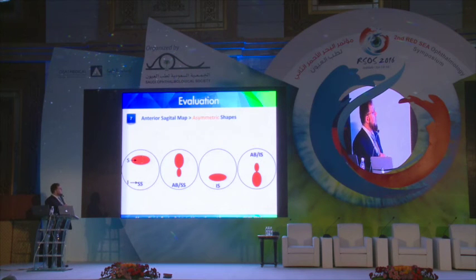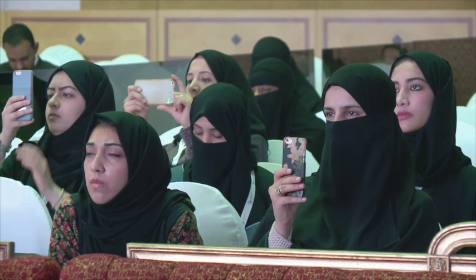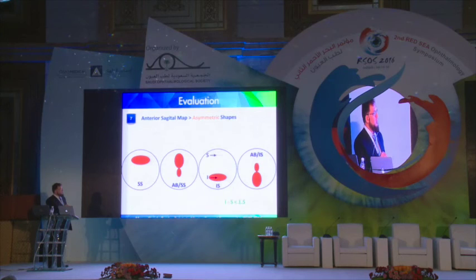When the shape is superiorly steep, as these 2 shapes, when I have the difference less than 2.5, then it is normal. And when I have the inferior steep shapes, when the difference between the 2 opposing points is below 1.5 diopters, then these shapes are normal. So not every asymmetric shape is abnormal.